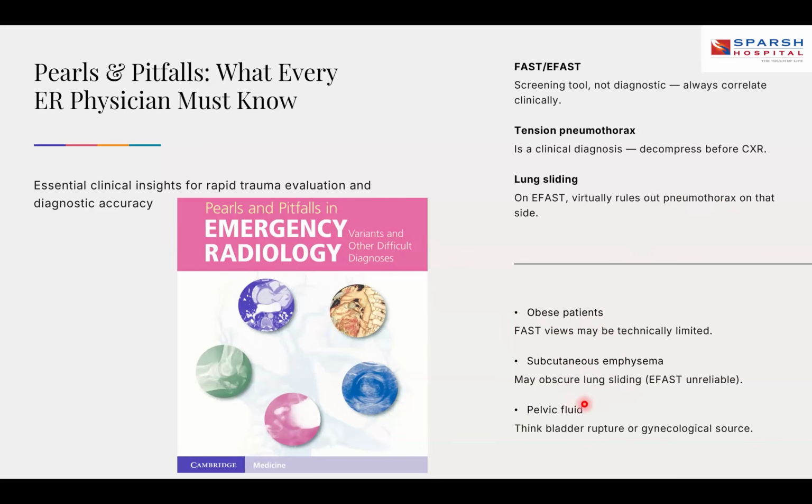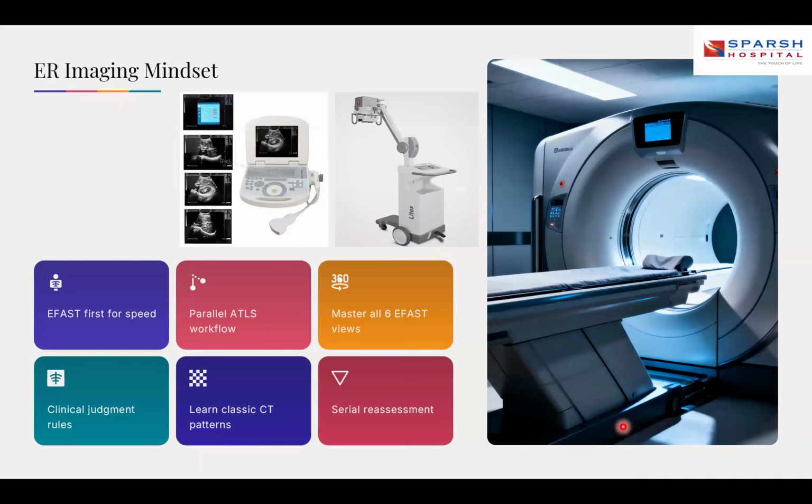If you have pelvic fluid in any of your scans, always think bladder rupture or a gynecological source. Stabilize the patient, start massive transfusion protocol if you need to, and immediately shift the patient to OT.